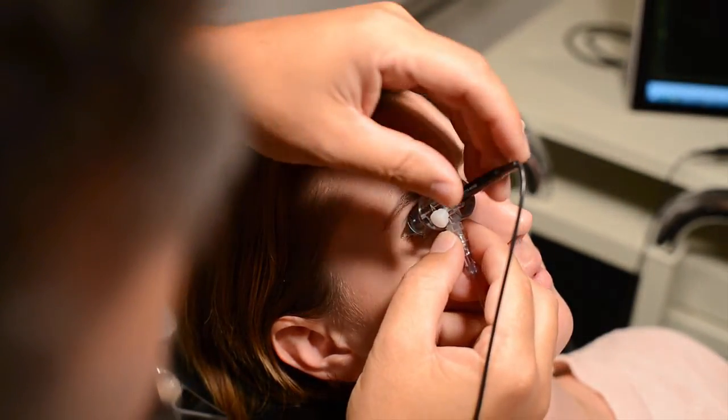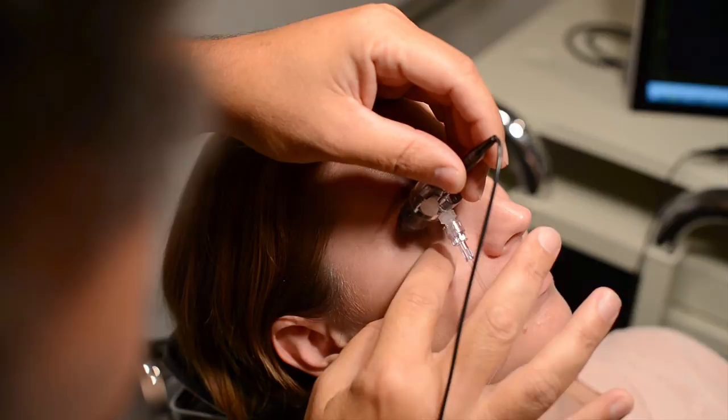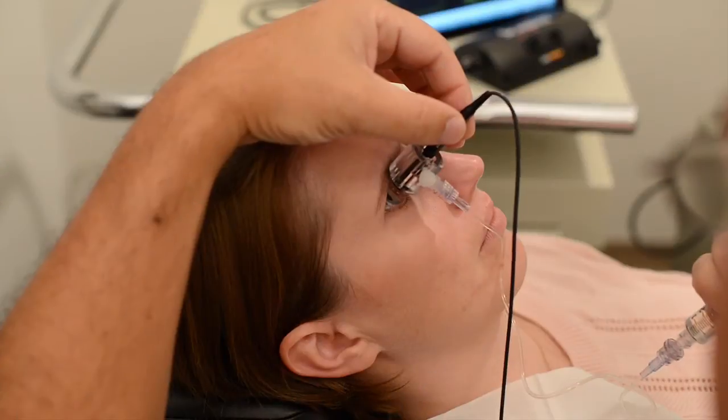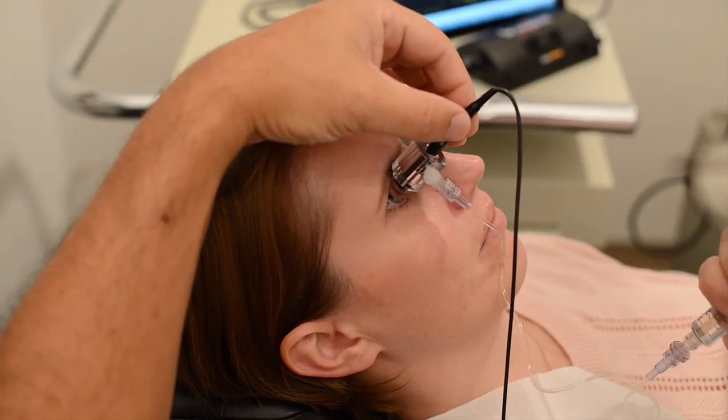Just insert the rim of the shell under the patient's eyelid, pivot the shell into position, add saline until the unit starts to beep, adjust your alignment, and hold still as the unit takes its measurements.